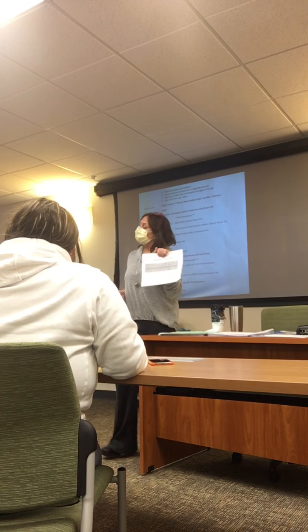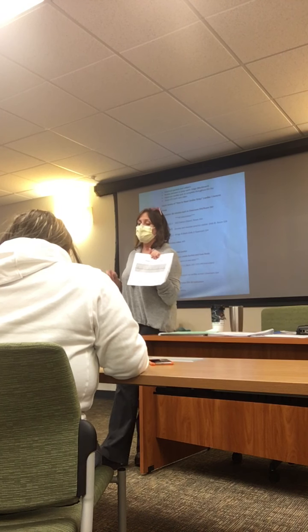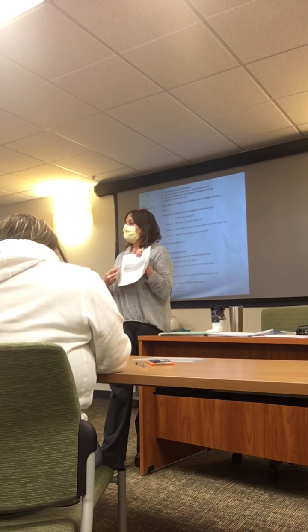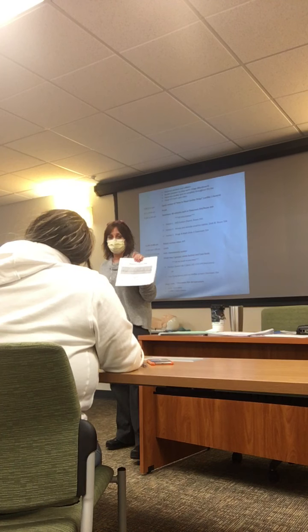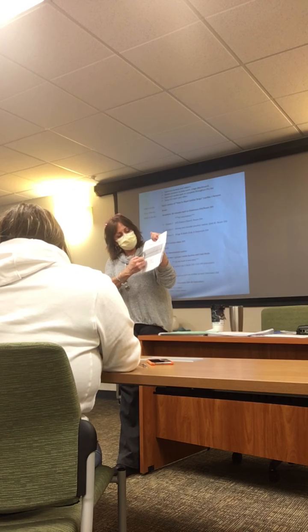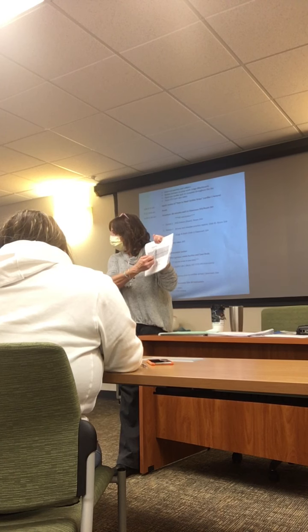All right, so to figure out the rate, I count the number of R waves in the 6-second strip, because the R waves are coming from the ventricle, and that's what's going to give me my pulse. So if this is a 6-second strip, how many R waves do you have? 8 or 9, depending. Actually, a 6-second strip would be in between these little boxes here at top, because it marks it off in 3-second intervals.